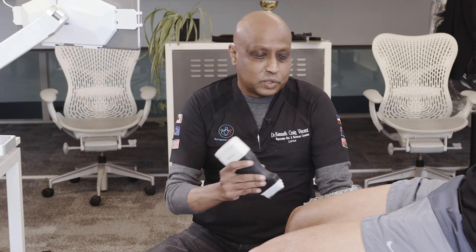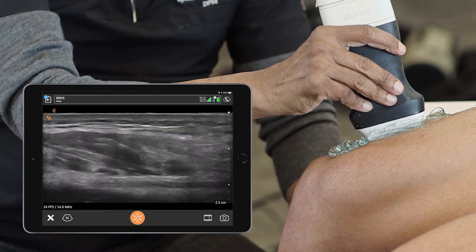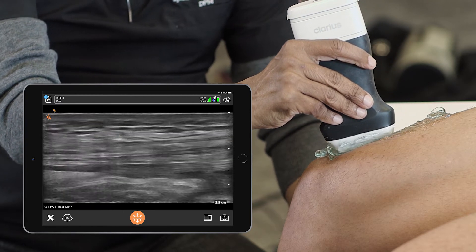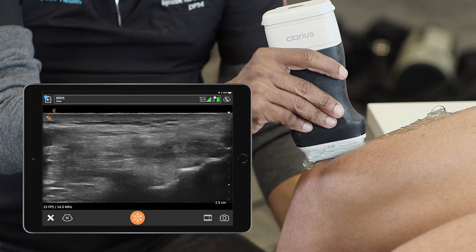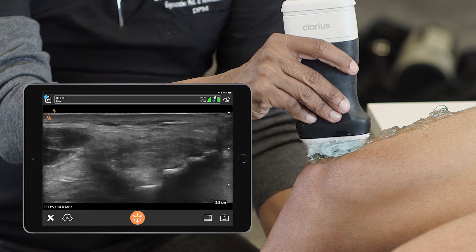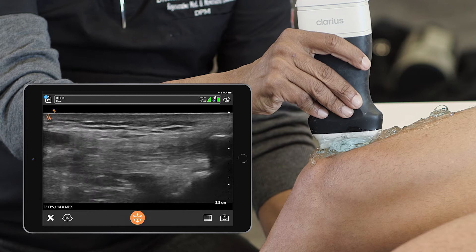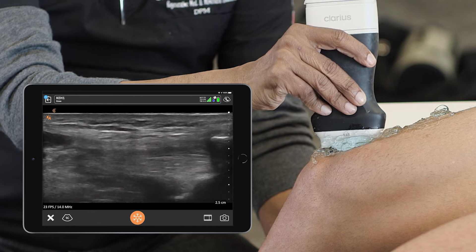Point of care, because he's preparing to qualify to compete again next June. I'm going to start from the rectus femoris, cranial to caudal. As we come now towards the superior pole, we find slight differences in both the tendon pattern as well as its course into the pole of the patella.